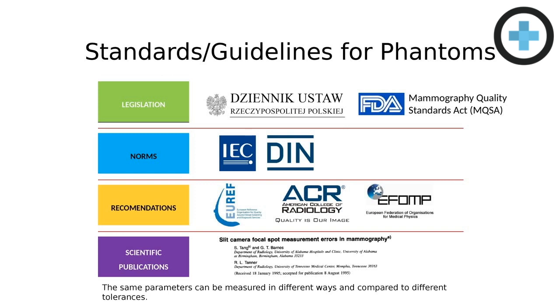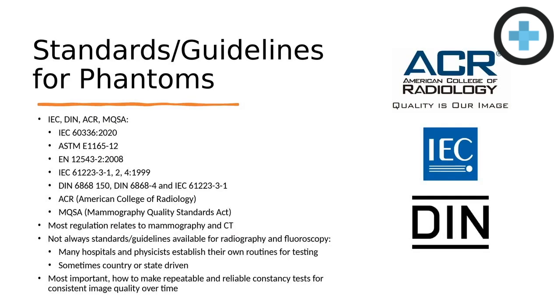So you can see here we have the top level. You might have legislation requirements. In Poland, and probably in the U.S., the most popular, the most well-known is the Mammography Quality Standards Act, overseen by the FDA. But after that, you primarily have various recommendations. As you look through probably any of our phantoms or any other manufacturer's phantoms, it's going to address a lot of these various standards, a word soup, if you will. So it's always important to know what standards are required, whether at your facility, or which country you're in, or even what state you're in if you're in the States.